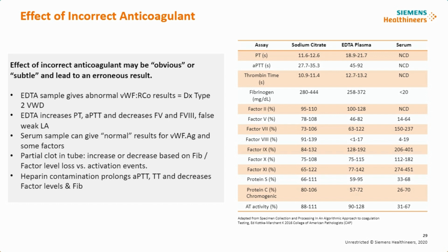So if you do suspect that the patient sample does in fact have EDTA, most oftentimes the tubes that are used are potassium EDTA. So one thing that could be done is to send that sample to the laboratory and have a potassium run on that sample. And what you would see is superphysiological values of potassium, indicating that the potassium EDTA tube was used for that particular plasma sample. Because sometimes there could be a mix-up in the blood, and it's put into the wrong tube and sent for coag results. And of course, your sodium citrate tube is the anticoagulant of choice.